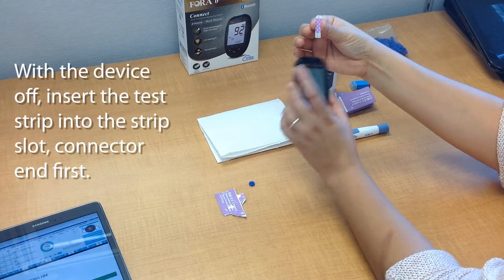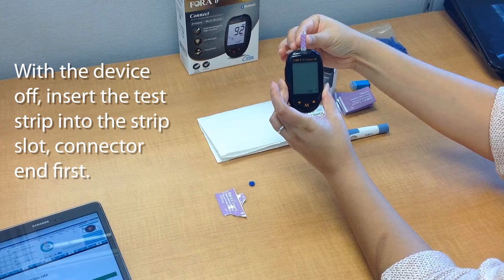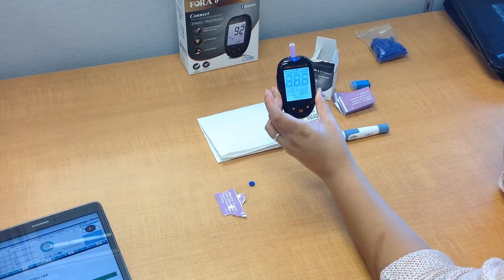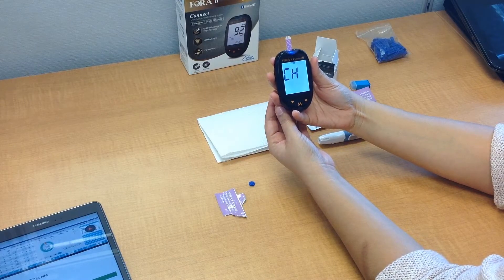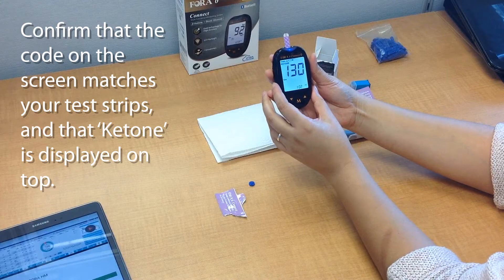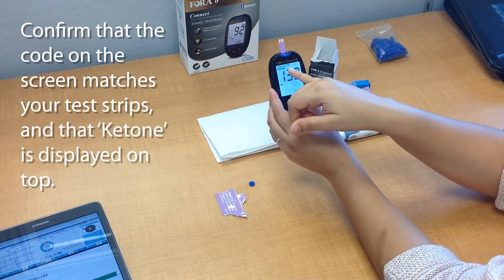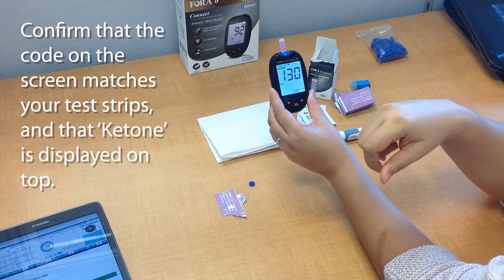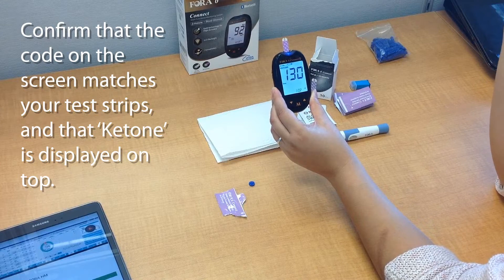Take the test strip — this is the connector end — and, facing up, insert it into the meter. That will automatically turn it on, and you will see the code that we entered at the start. You'll also see a blinking blood drop on the top, as well as the word 'ketone,' which confirms that you're doing a ketone test.